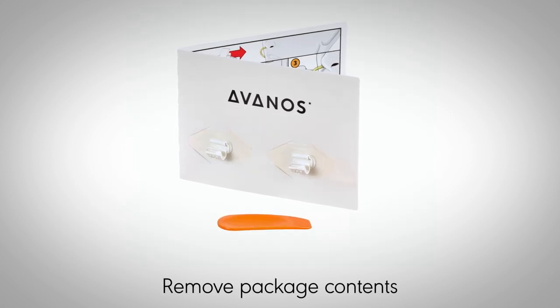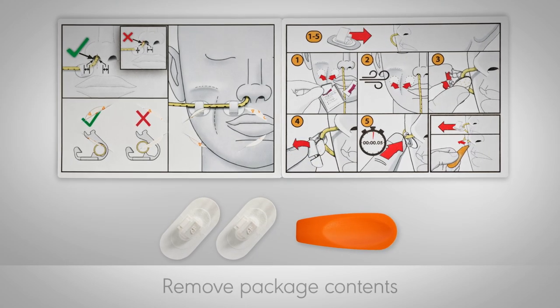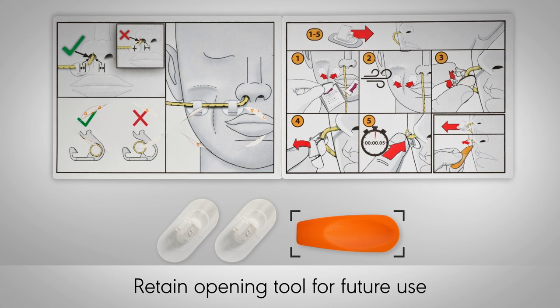Remove the contents of the package, which contains two tube anchors, a user guide, and an opening tool. Retain the opening tool for future use.